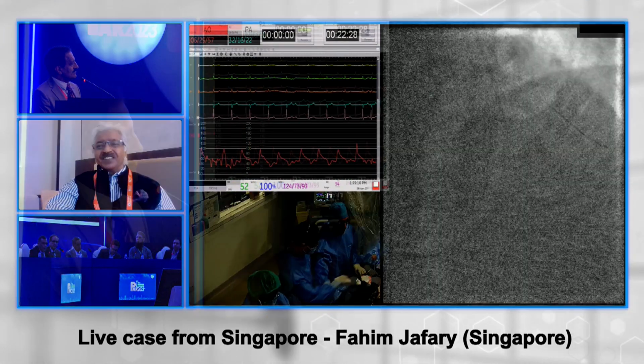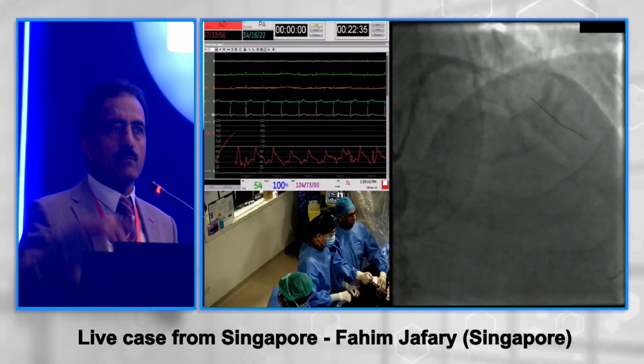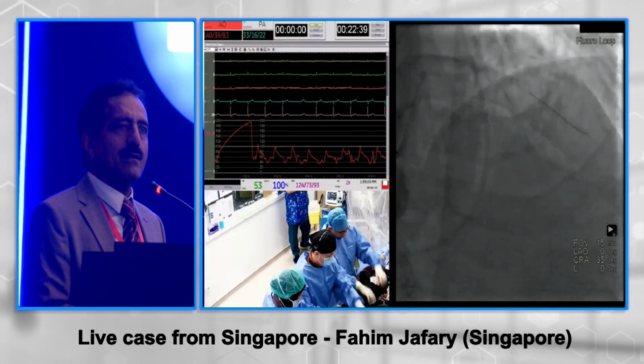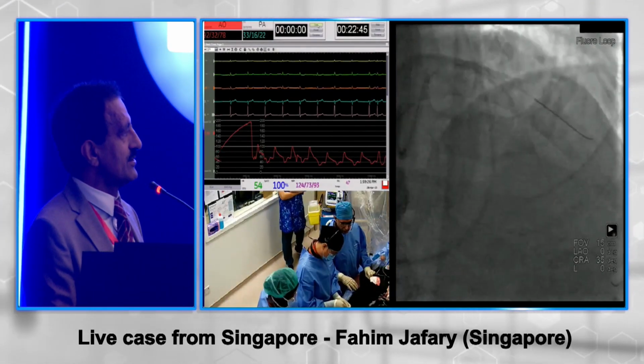There's a question. Let's take the IVUS. Any other comments from panelists? Not really. So we're just going to do a quick IVUS. If you have a minute, we can show it to you.